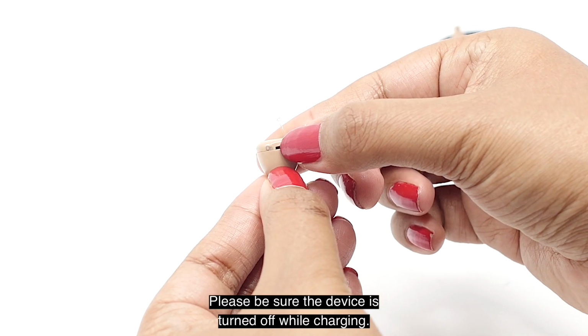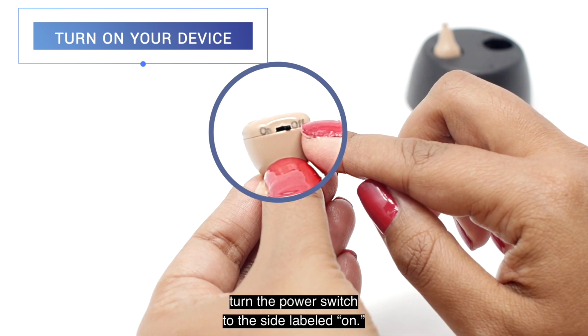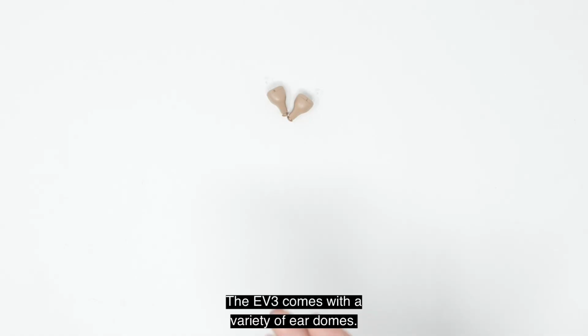Please be sure the device is turned off while charging. To turn on your device, turn the power switch to the side labeled On. To turn off your device, turn the power switch to the side labeled Off.